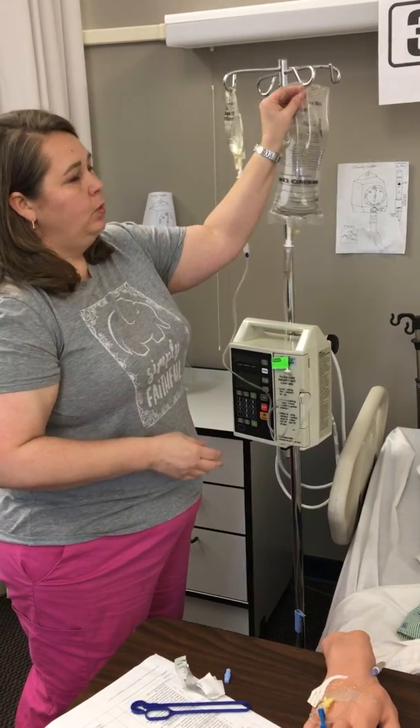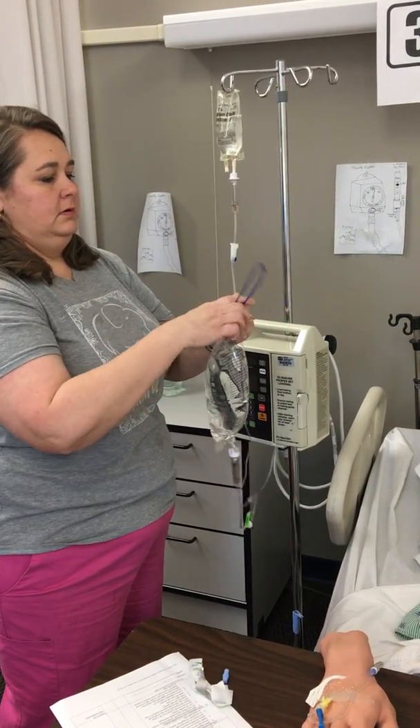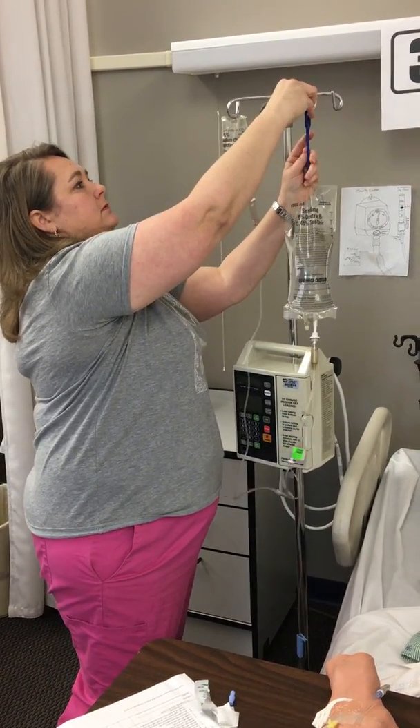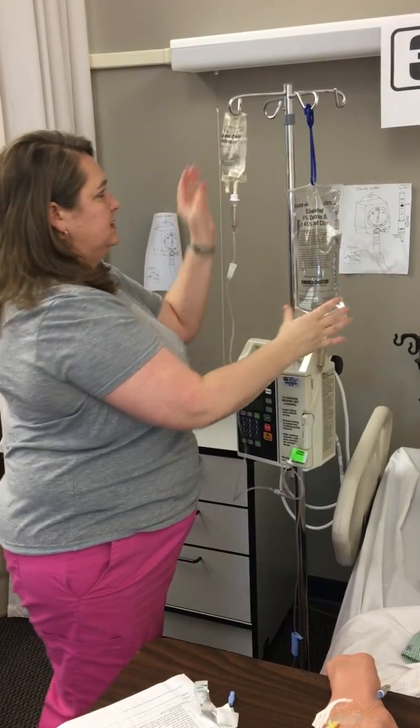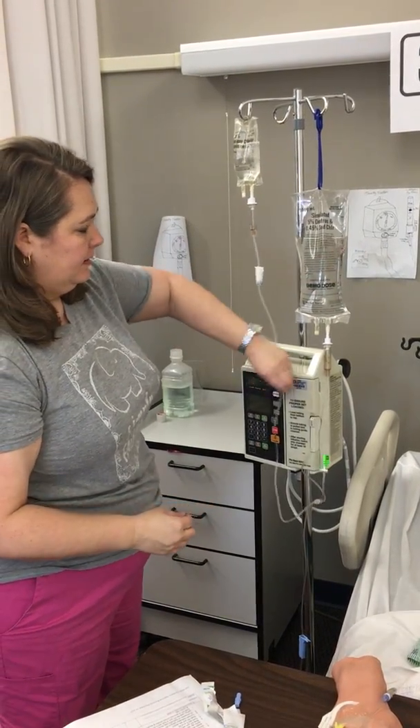At this point I need to lower my primary solution. That's what the hook provided in your secondary set is for. My piggyback will run ahead of my primary.